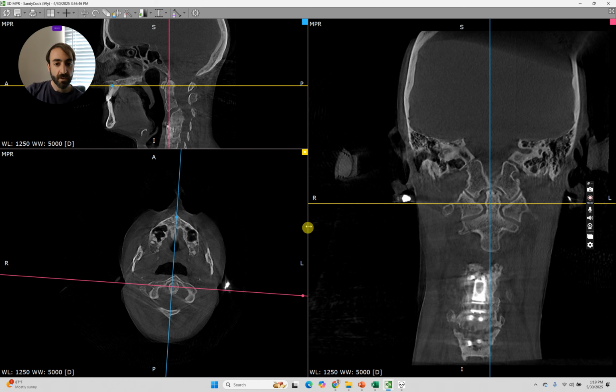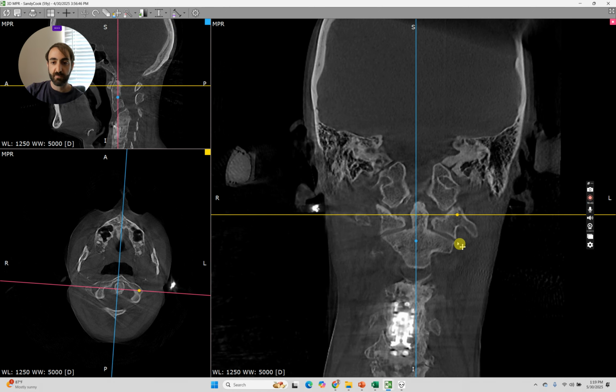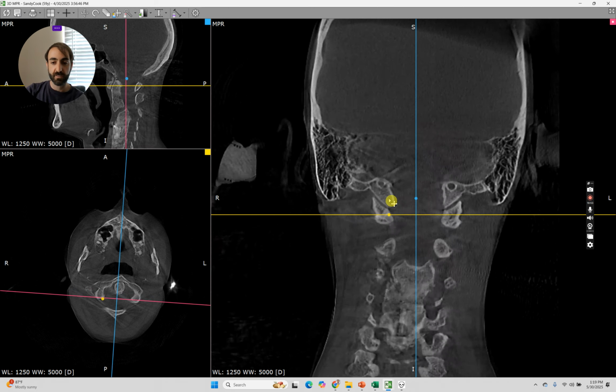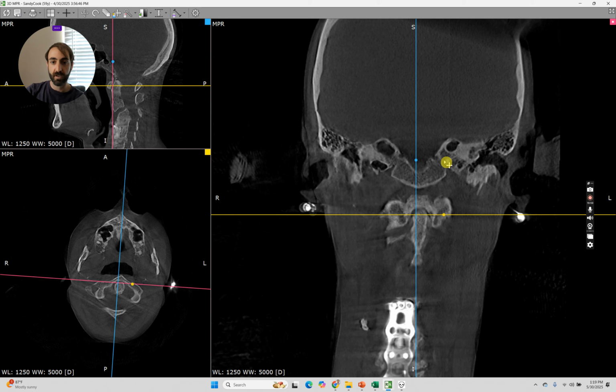And the second way that I check that is that I'll scroll through it here, slice by slice. And as we come slice by slice, you see how this mastoid is appearing before this one on the right side, which would suggest that it's a little rotated still. And if we come all the way up to the jaw or the eustachian tubes, do those look like they're opening up?